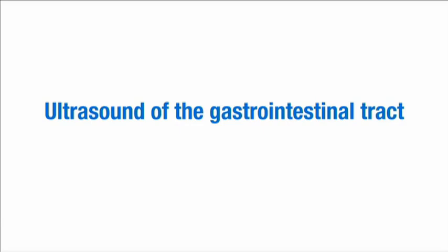This video demonstrates how to set up and perform an ultrasound scan of the gastrointestinal tract.